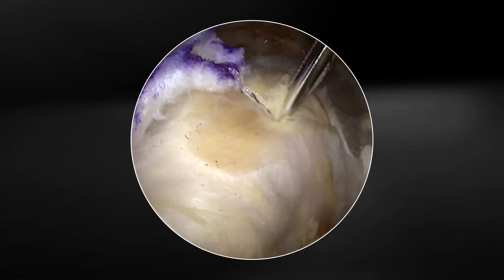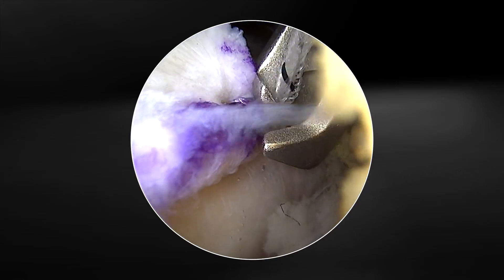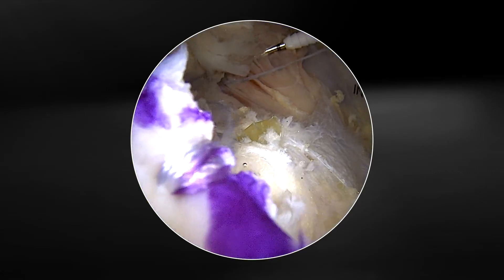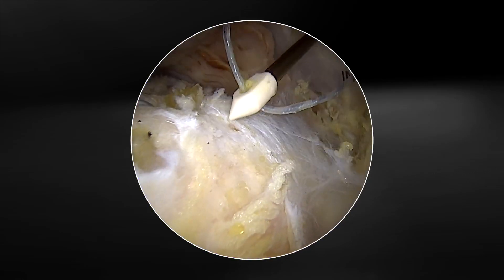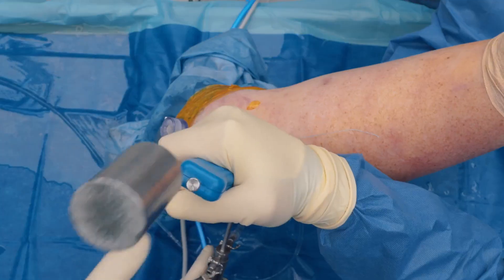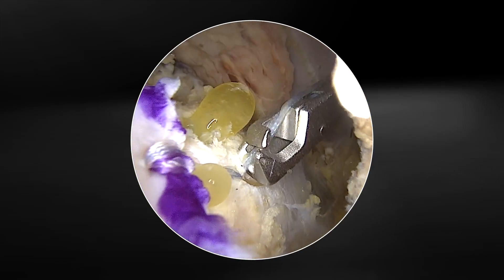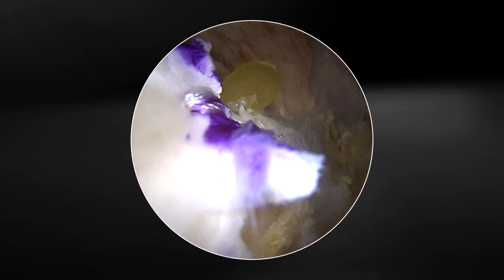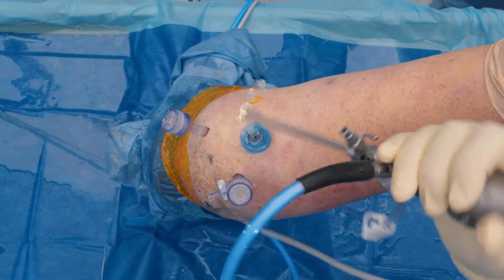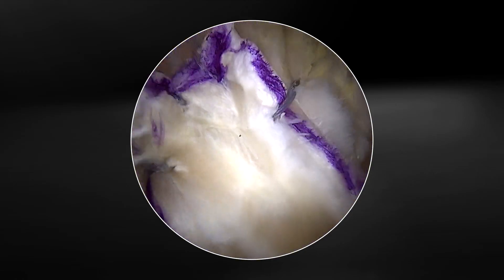This nicely restores the patch directly on top of the tendon. We then cut the excess suture off the graft and our posterior lateral row is complete. The self-punching push lock is then introduced into the portal again. We decide where we want this push lock to go and tap it in. An open cutter comes in and finishes up the edge. This completes the patch laterally and medially, and you can see that we now have a speed bridge repair augmented by an autograft biceps tendon.